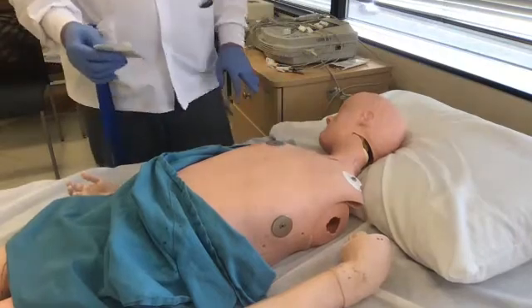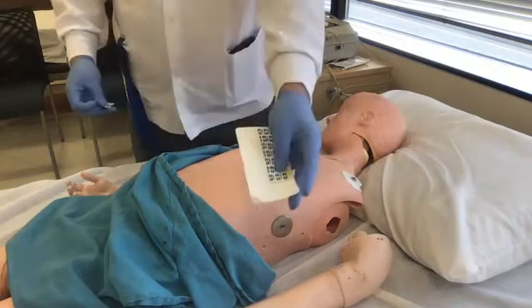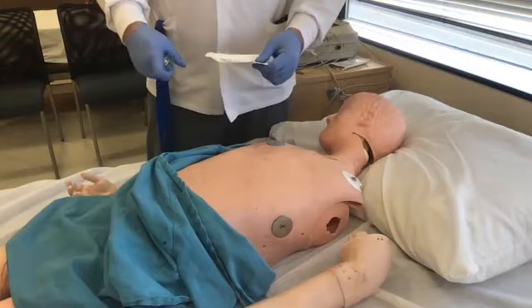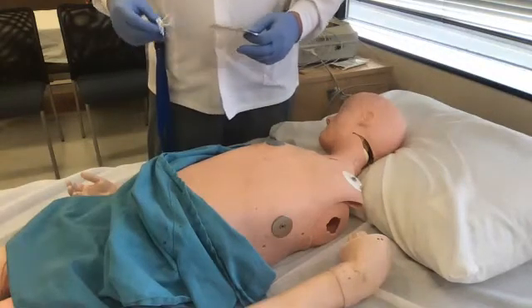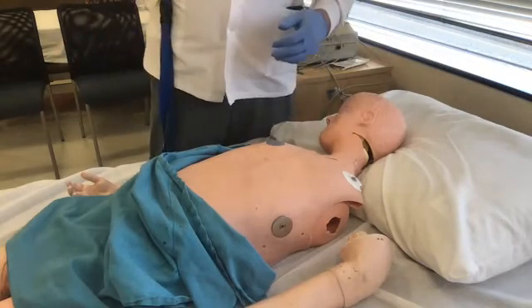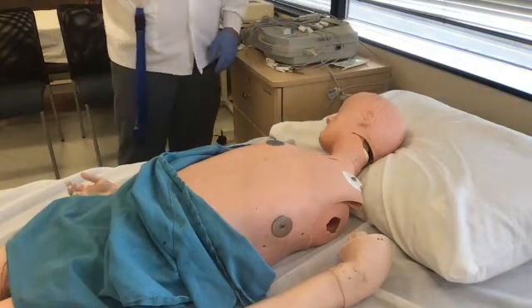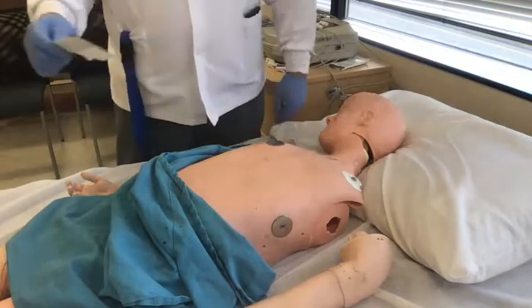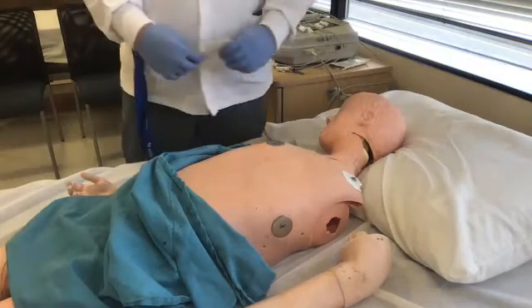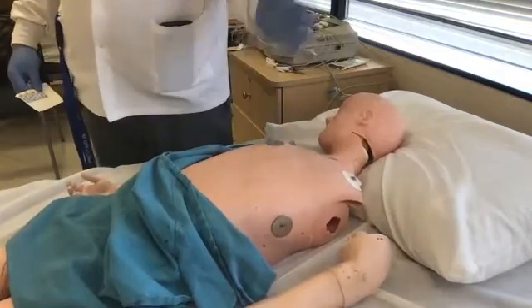So guys, practice this, and here's some extras. Sometimes you always get extras or whatever, like this. I like putting them in a nice little envelope. And remember my adage regarding equipment: 2 is 1, 1 is none. Always have your backup. So I like putting an extra set, especially if I know I'm doing EKG. Or if I have the drawer, I've got an extra. Like any cardiologist office worth their weight, they've got a drawer full of extras like this. Okay, so guys, practice that, and then you do it once or twice, you should be good.